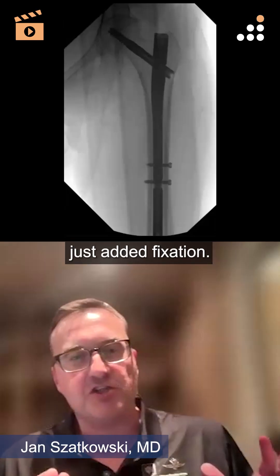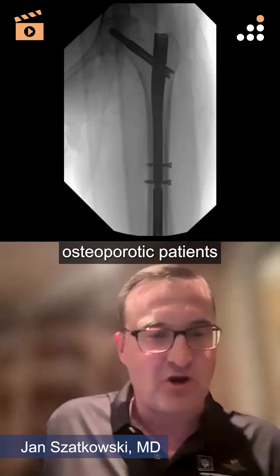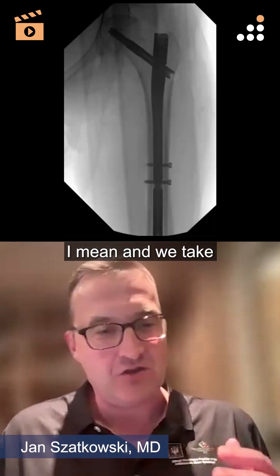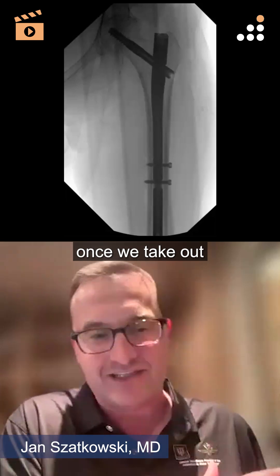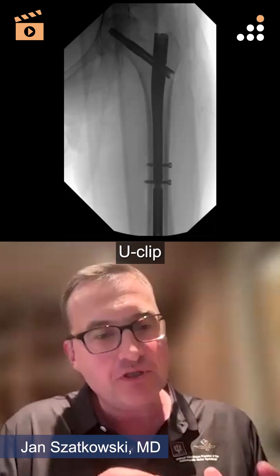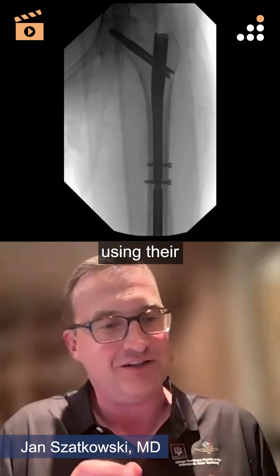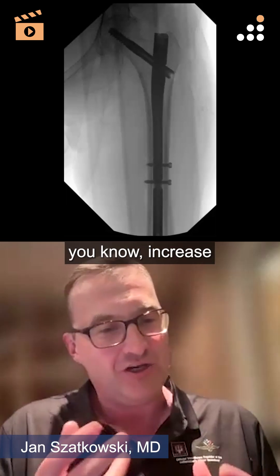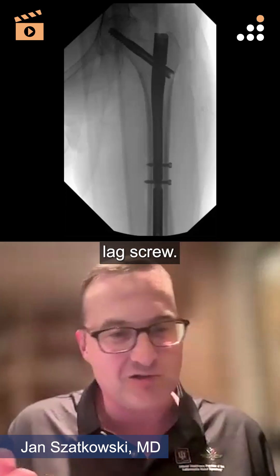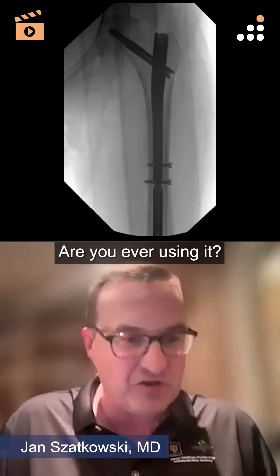Another point about added fixation — these are osteoporotic patients we're dealing with, right? That's why they're getting hip fractures once we take out the high energy ones. Are you ever using the U-clip, basically using it around this to increase the fixation proximally — what they call the RC lag screw? When are you using it?